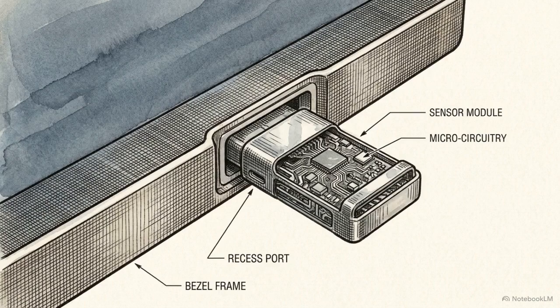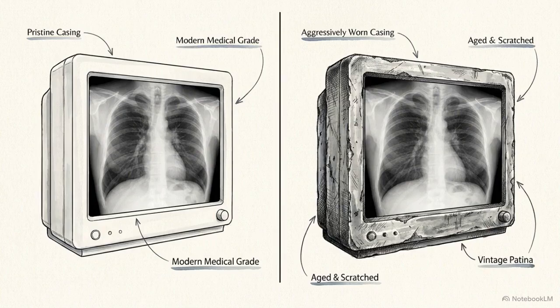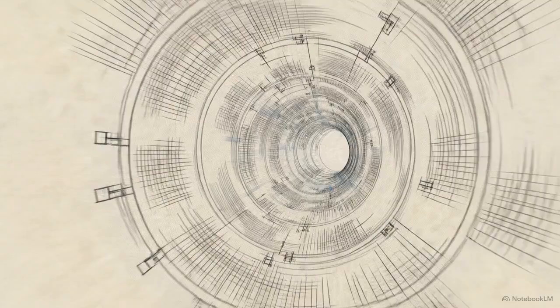Maintaining that strict curve requires immediate hardware intervention. LED backlights degrade over time, so internal sensors continuously modulate the backlight voltage to stabilize luminance at 1,000 candelas per square meter. DICOM calibration is a continuous, active mechanical process combating the physical decay of the display. If we trace that calibrated signal backward from the monitor and into the wall, we enter the routing architecture.